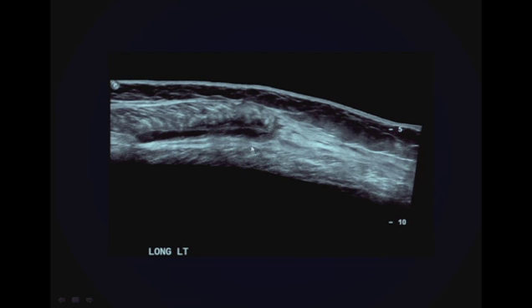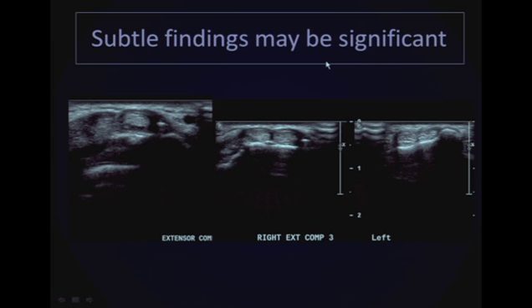Knowledge of history is very important. Talking to the patient is very important. And again, this panoramic view is also very useful because you can see that there's a plantaris tendon rupture. Not only that, the muscle fibers of the gastrocnemius are disrupted. So this patient not only had a plantaris tendon rupture, but also a gastrocnemius muscle tear as a source of her pain.